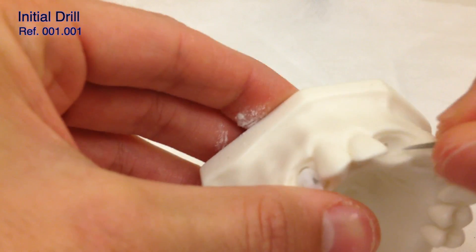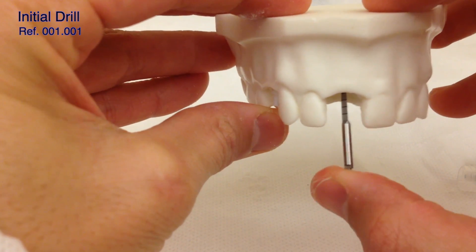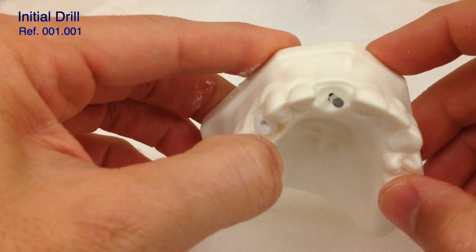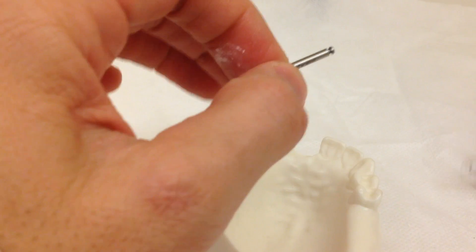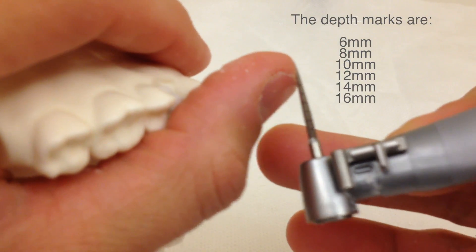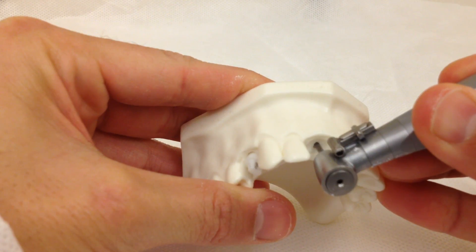Now we can see that the osteotomy has been pushed to the buccal, and in terms of the mesiodistal it's pretty much in the center — we might need to push just a little bit more distal, but more or less this is the direction to follow. If you look at the alveolar bone we are also in the center of the bone. We're going to go now all the way to 14 millimeters. The depth markings go in increments: 6, 8, 10, 12, 14 — the second to last line is where we want to go. Irrigation is important.